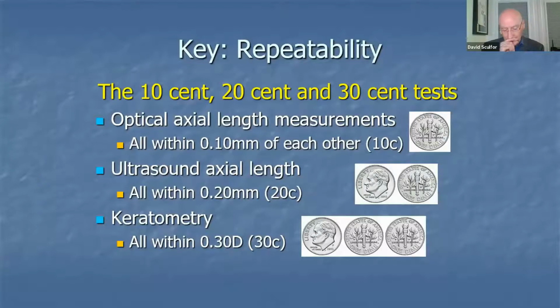So this came about because one of our nurses, who will remain nameless, when I was teaching her to do biometry, I was trying to get across to her the importance of having all your measurements within fairly narrow margins. So I said, right, if you've got a measurement of 43.6 and 43.8, you've got a difference there in keratometry of 0.2 of a diopter. And she said, oh, I don't understand diopters, I get all flustered with them. So okay, forget, oh, I gave her name away. Forget diopters, think of it in pounds and pence. If you go across the road to Asda, and you've got something which costs £43.60 and something else which costs £43.40, what's the difference? So 20p.